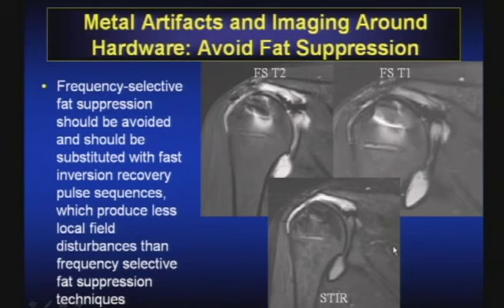They'll do a gradient sequence, they'll do chemical fat suppression, they'll do everything that you don't want them to do because it's not in their mindset. Right? So as we start to image more and more around metal, it will become a part of their mindset. But until then, I think you have to be very specific with your protocols. So say, don't use gradient imaging. Don't use chemical fat suppression, right? They're not going to do things that would make an image worse to them, right? Because normally you want to do the other. So you have to be very specific with your text.